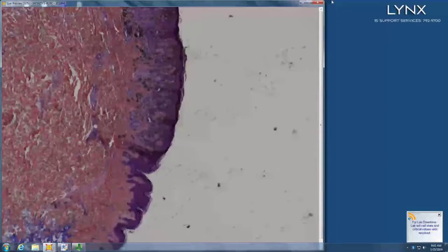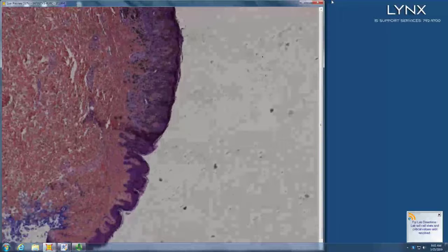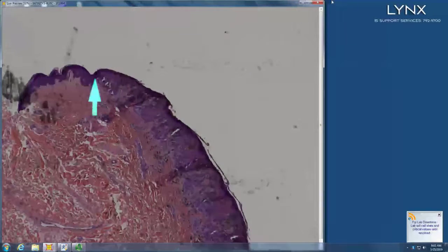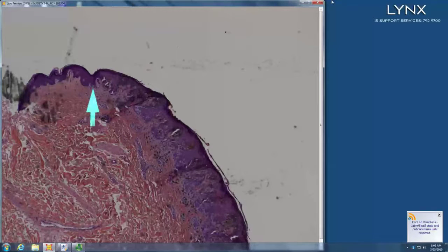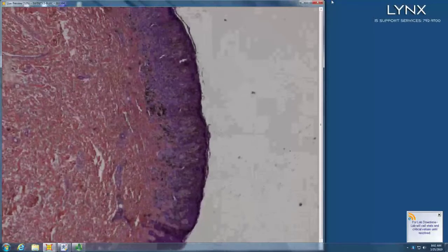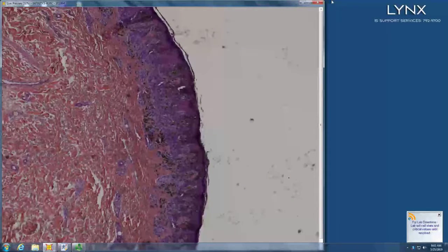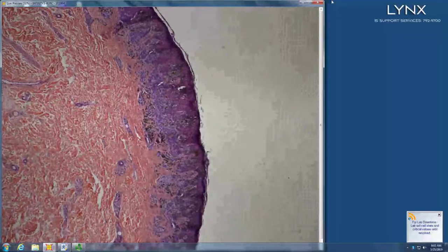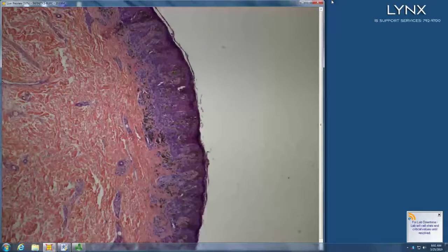So, is it sharply circumscribed or poorly circumscribed? It's sharply circumscribed, ends in a nest. Spitz. What kind of Spitz? Is it small spindled cells? Reed. Yeah, sort of like a Reed nevus. And now it looks like there's unique genomics in Reed nevus.